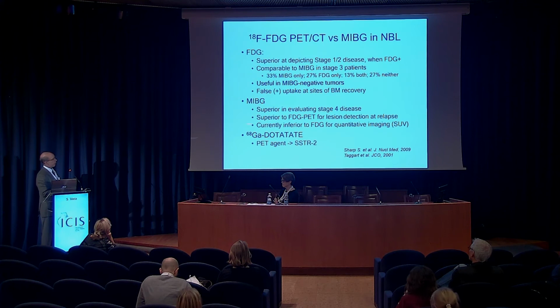MIBG, in contrast, is our workhorse for the moment. Not great if you need to do quantitative imaging. Dotatate is something I'll show you just at the end. That's something that I think you're going to start to hear more and more about as an alternative to MIBG.